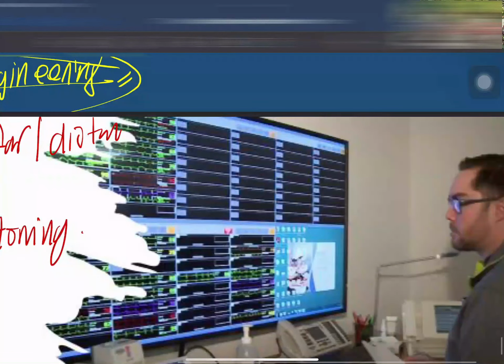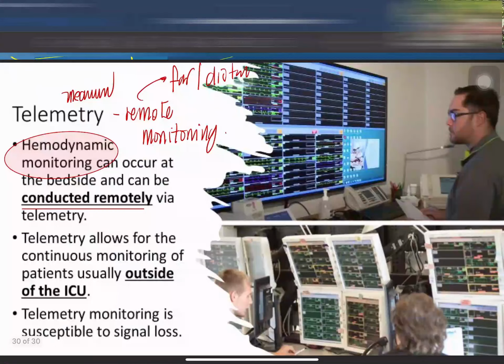According to my colleagues abroad, what do they do, class? Diyan lang sila, nakaupo. Entire 8 hours, maupo ka dyan, tingnan mo pag may abnormal. Pag may abnormal, anong gagawin mo? Tatawagin mo yung nurse in charge. Sasabihan mo, oy nurse, si room 1 mo may abnormality. Habang ikaw nakaupo lang dyan, class, and developing hemorrhoids. Ano? Pero class, in abroad, there are people who are already assigned in the telemetry just for the purpose na mag-monitor ng pasyente sa screen.